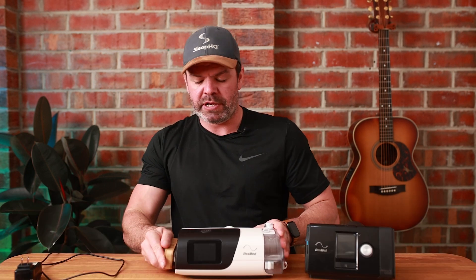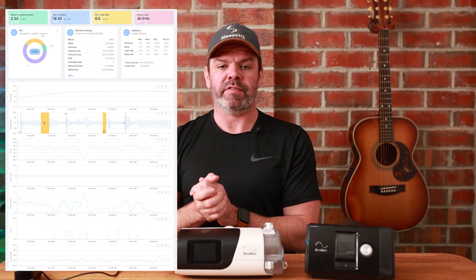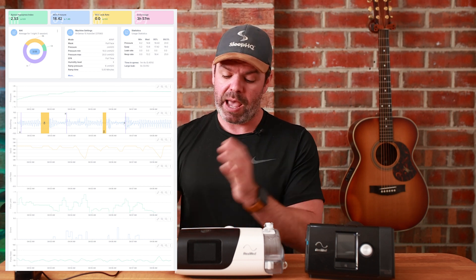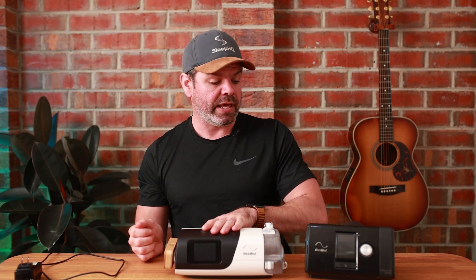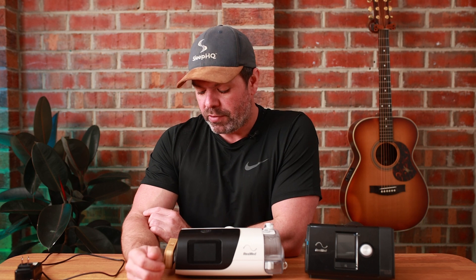And in the morning when you wake up, all your data's right there. You can open up your phone and see exactly how you slept, how many apneas you had, and so on. It works with the AirSense 11, AirSense 10, and the S9 device — and probably the S8 as well, though I haven't gone back that far.